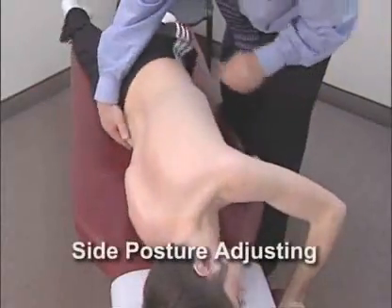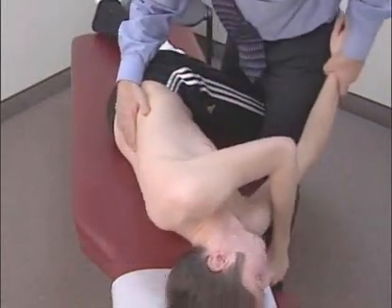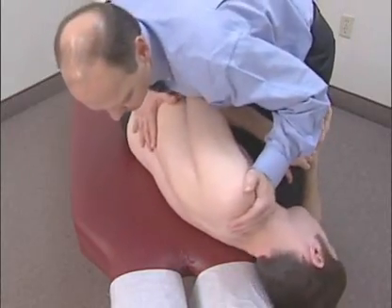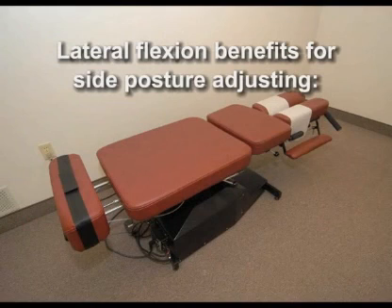Adjusting side posture on a straight bench table can be a struggle for the patient and for the practitioner. The patient either feels as if they are going to fall off the table, or the doctor struggles to keep the patient on the table. Lateral flexion of a flexion distraction table has several benefits for side posture adjusting.